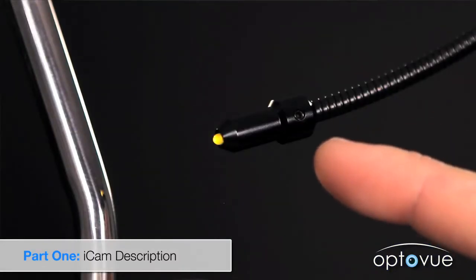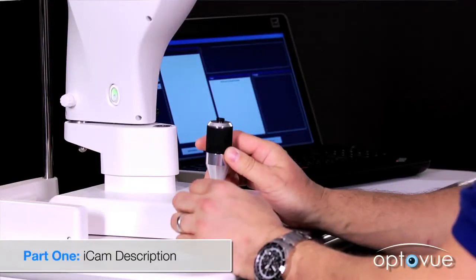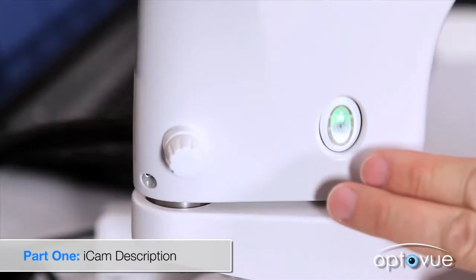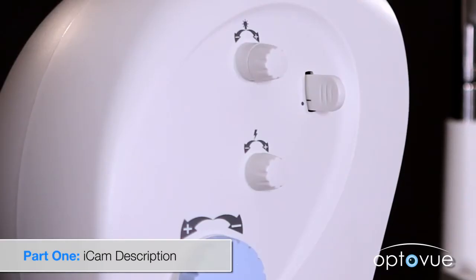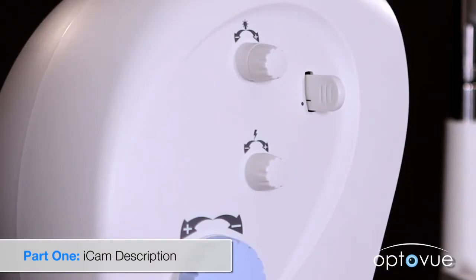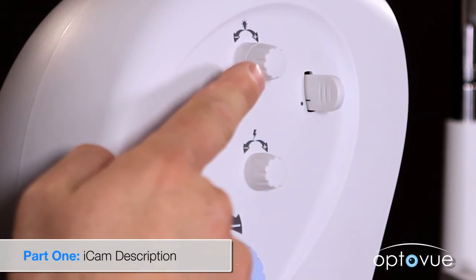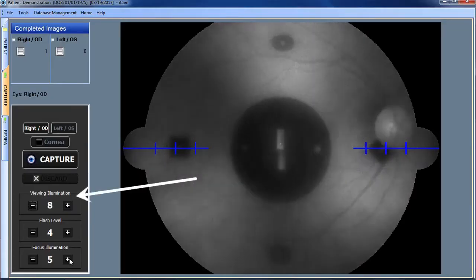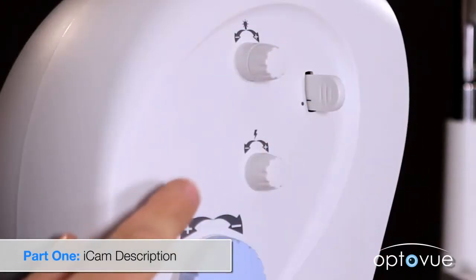Please refer to the install manual for further detail. Turn the camera on — when on, the switch will light up. Starting at the top of the camera, there is the viewing illumination knob which is adjustable from 1 to 12. This controls the infrared illumination of the retinal image that the operator sees on the computer screen and illuminates the fixation patterns for the patient.